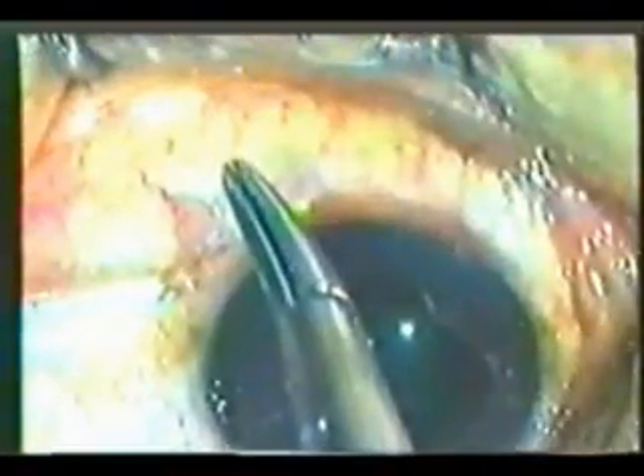He is checking the surface, and now the sticky side is facing up. He intentionally used the sticky side up.